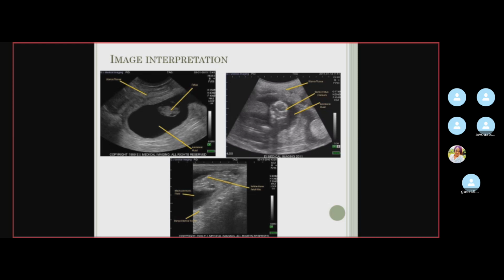These are a few images of the ultrasound machine. Is it visible for everyone? Yes, madam. You can see the images are in shades of gray and black. There is a scale on it here. Can you see the marker? Yes, madam. This scale is called the gray scale.